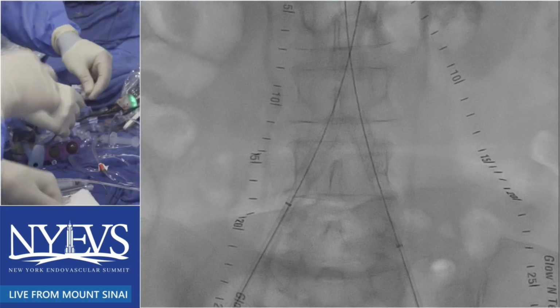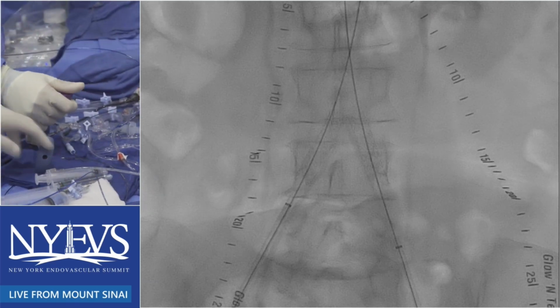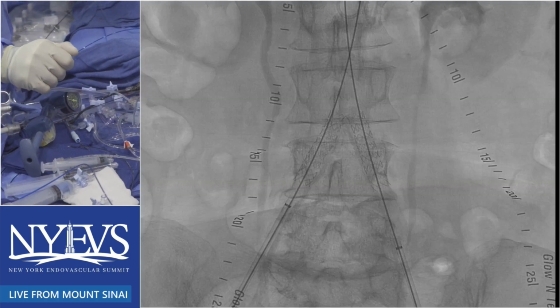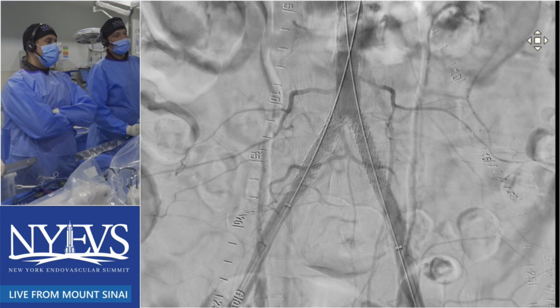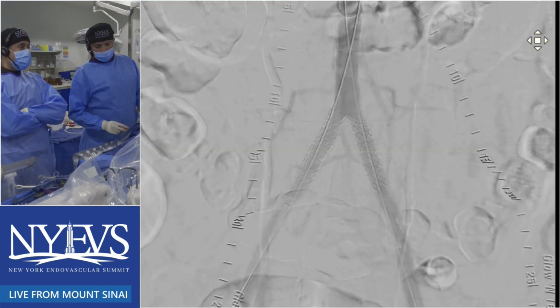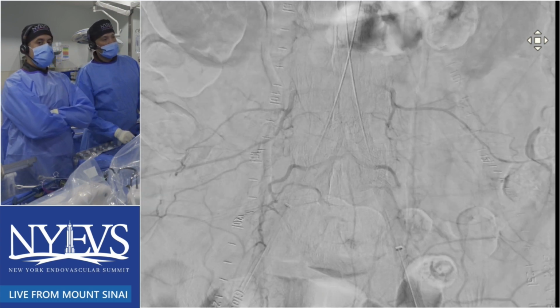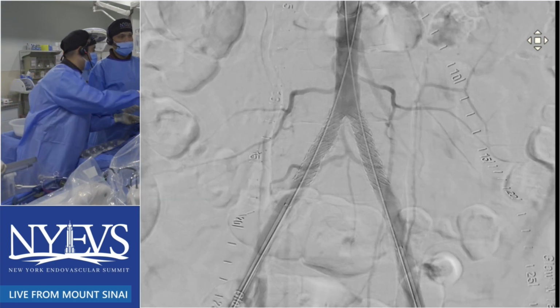All right, ready? What do you guys think of IVUSing after the angiograms, or depending on what the angios look like? Yeah, that's the plan. Oh, it's beautiful. Looks great. So Karthik and Vishal, what we're going to do is go to Kingsport, Tennessee, see what they're up to. And if you guys decide to IVUS, we'll come back and take a look. Okay? Yes, that's what we're planning.